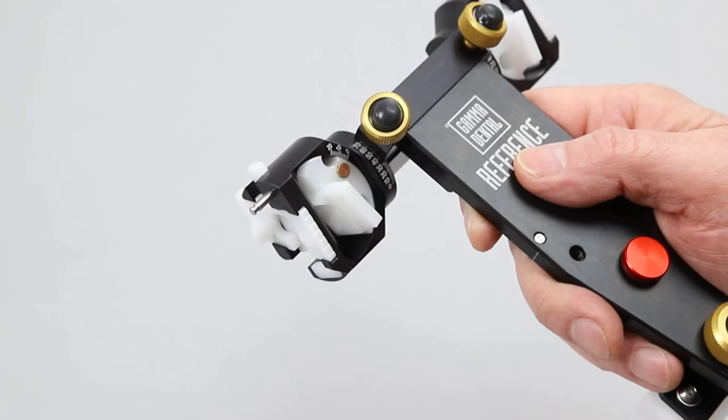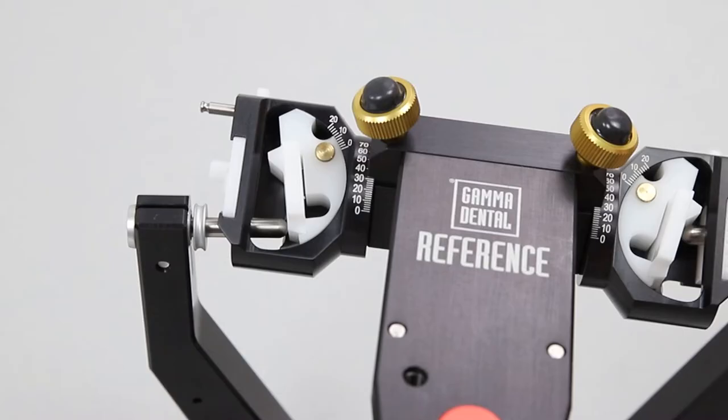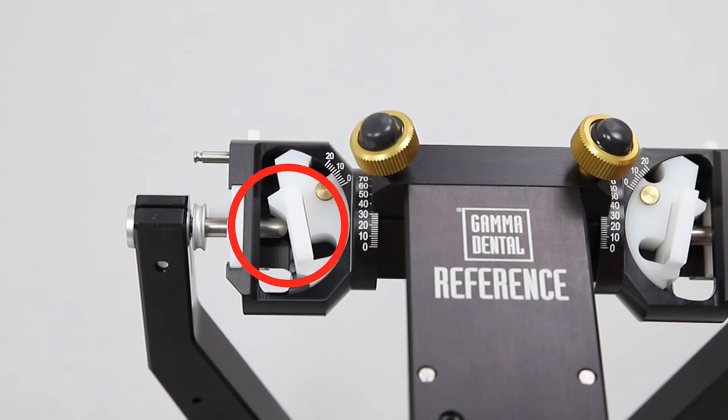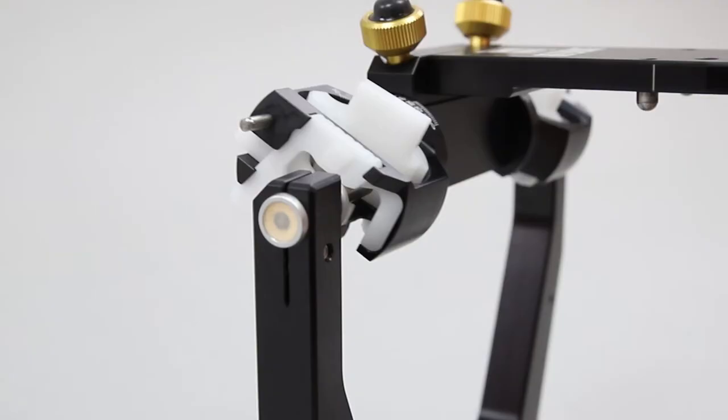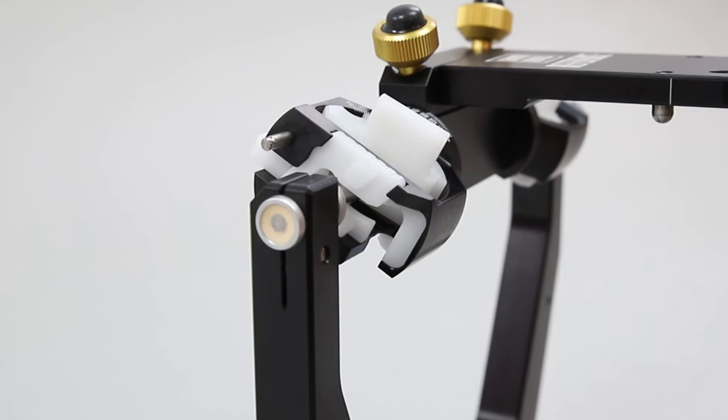This axis connects to the upper member by sagittal and transversal guide elements. Posteriorly, the movement capacity of the articulator axis is limited to the centric position. Anteriorly, the axis can move according to the characteristics and inclinations of the sagittal and transversal guide elements.